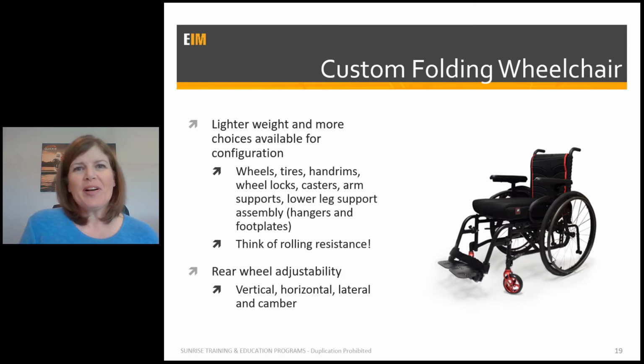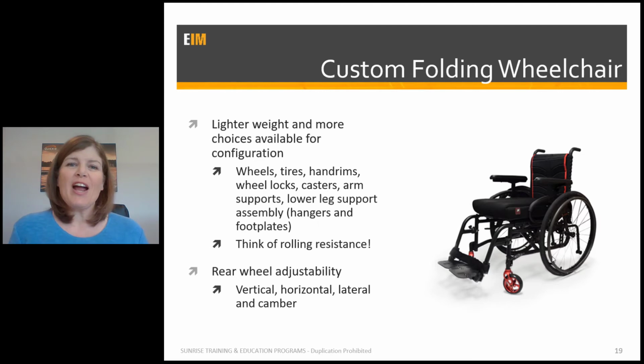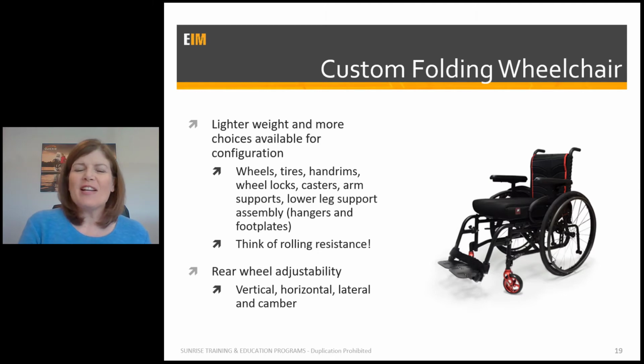Now, when I'm talking about custom folding and custom rigid, I realize that what I'm talking about is perhaps ideals. And I'm not going to get into funding and what people qualify for in the different parts of the world. I'm talking about an ideal configuration for reducing rolling resistance and looking at some other factors for clients.